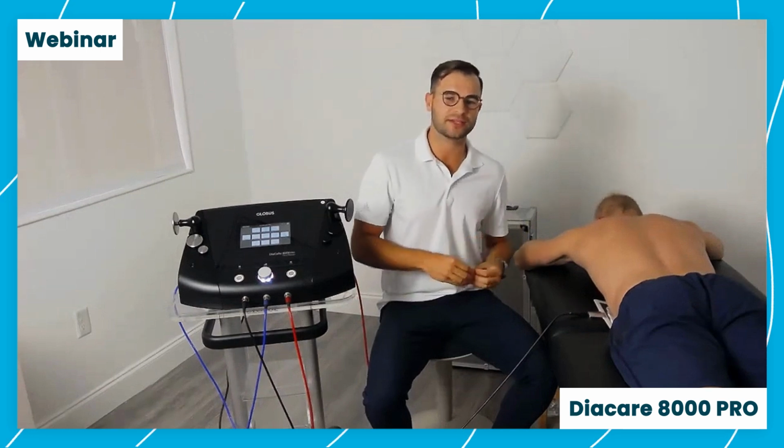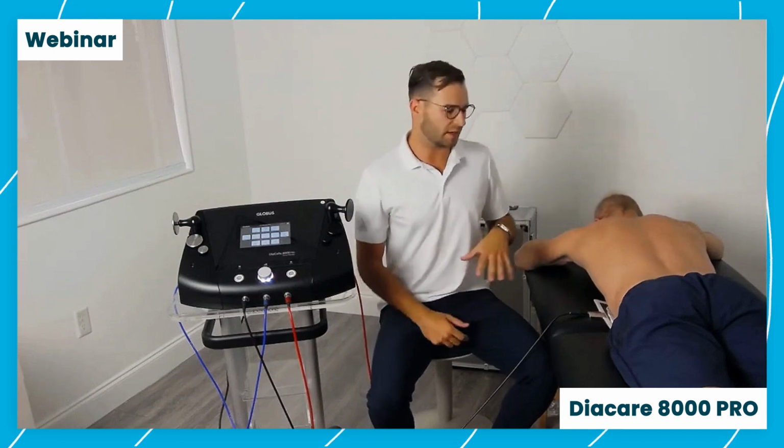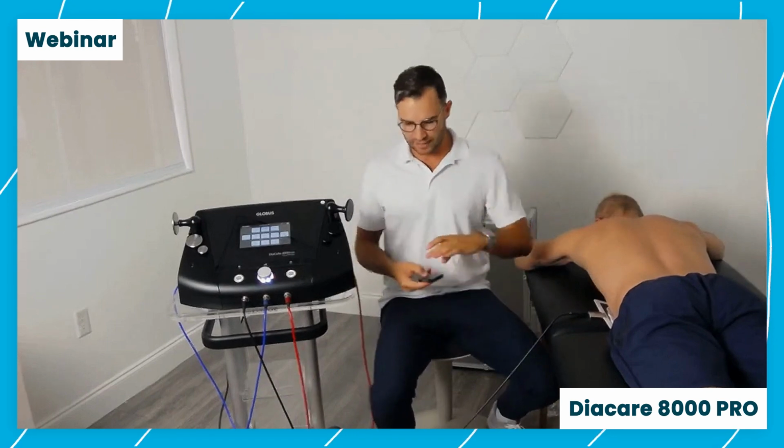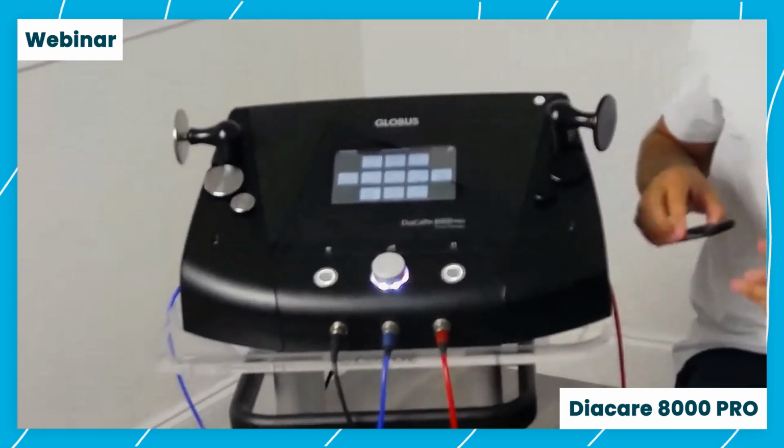We want to make sure that that patient is comfortable. We don't want to be building up so much heat that they're uncomfortable, it's too hot, and that they're jumping off the table, of course. And then, of course, the geography, like we're just talking about here. So as we get started, we're going to zoom in here at the Diacare so you can kind of see what's going on.